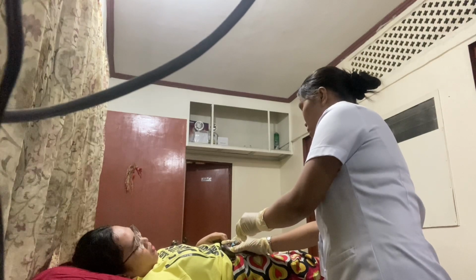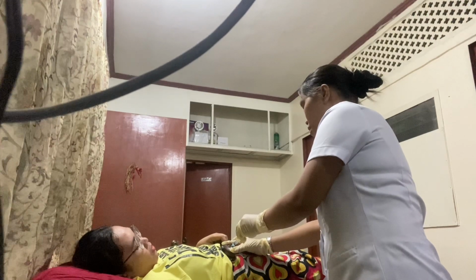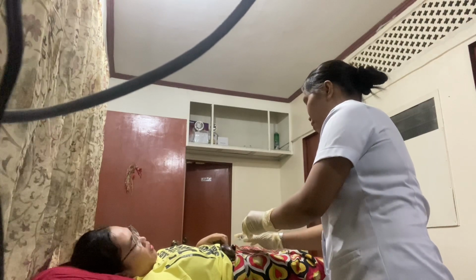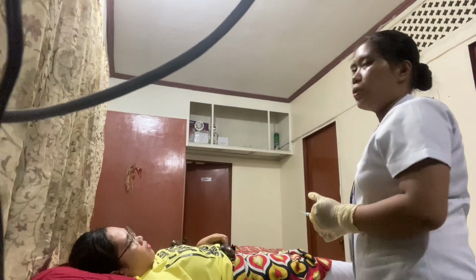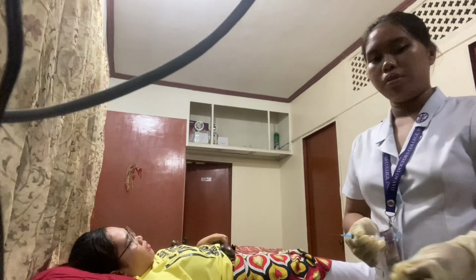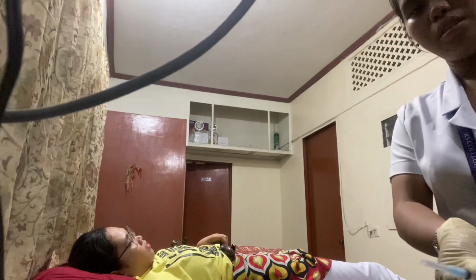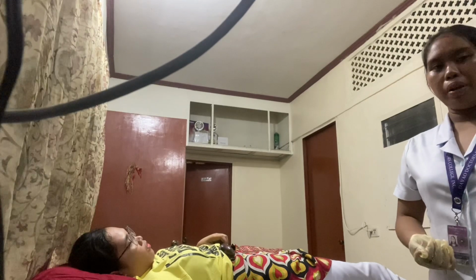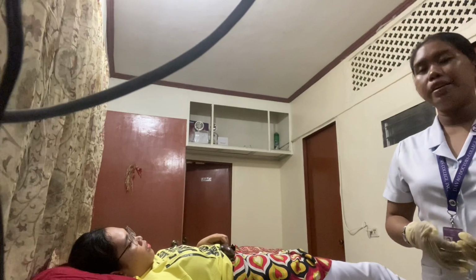Then after that, remove the needle. Remove the needle smoothly. This is to minimize client discomfort. So after that, if bleeding occurs, apply some pressure with a dry sterile gauze. Now I'm going to put the needle cap on after I use it and discard it after. And now dispose of supplies appropriately. This is to prevent injury to you and other healthcare workers.